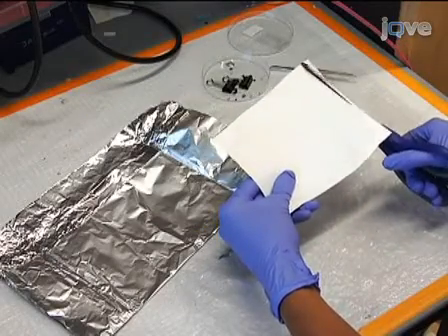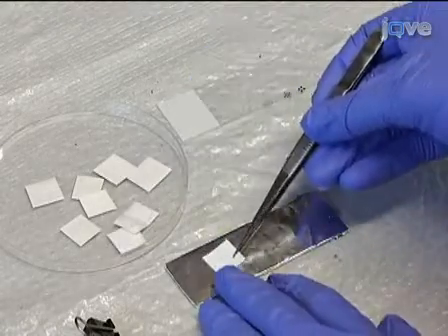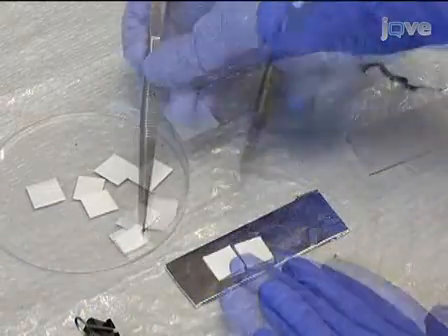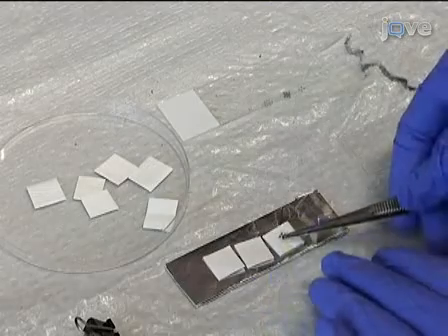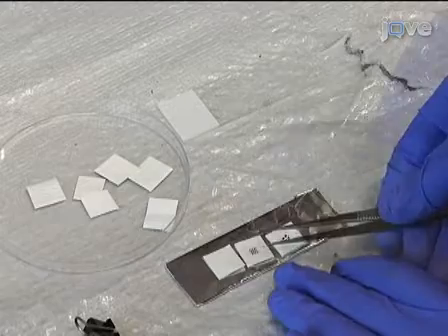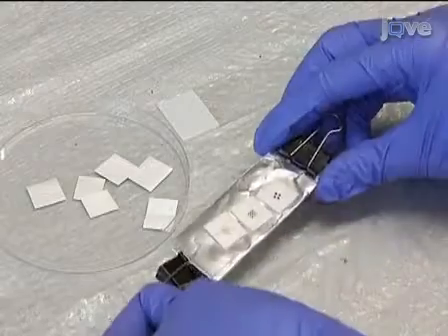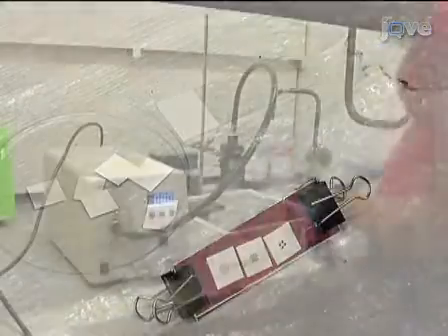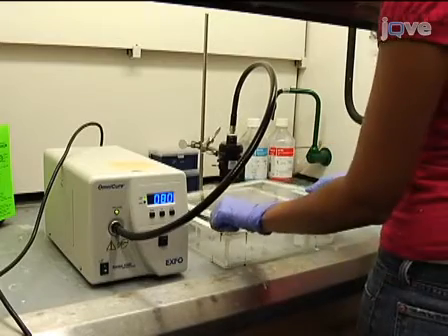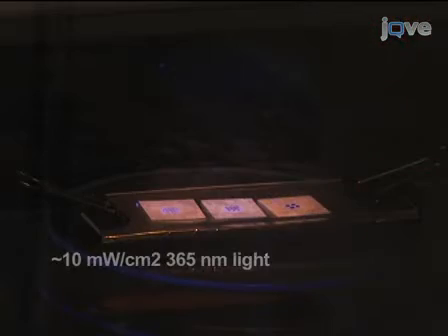Cut out 5 mm by 5 mm samples from the scaffold mat with scissors. Place each scaffold on a foil-covered glass slide to prepare for cross-linking, and place the photo mask directly on the scaffold. Cover with a clean glass slide and clip both ends with binder clips. Using a nitrogen chamber, purge the scaffold to inhibit reduction of cross-linking due to oxygen exposure. Place the scaffold setup in the nitrogen chamber under about 10 mW per cm squared, 365 nm light with a collimating adapter, for 5 minutes.